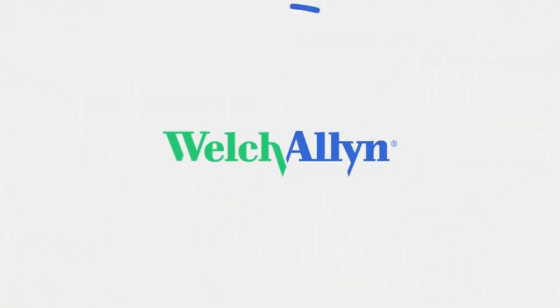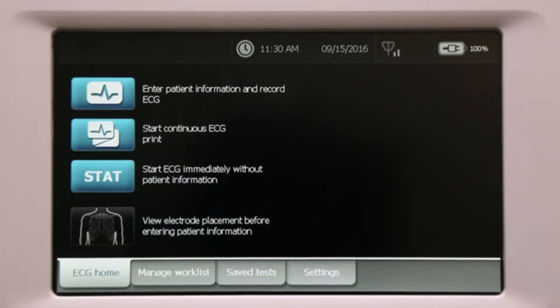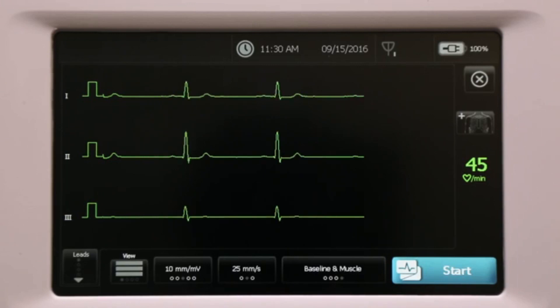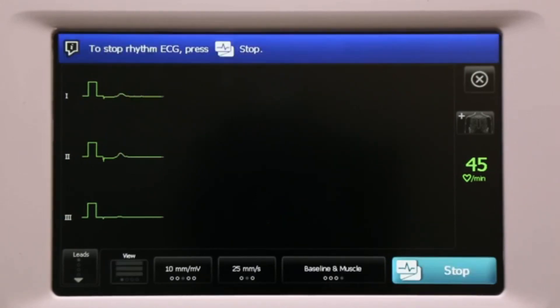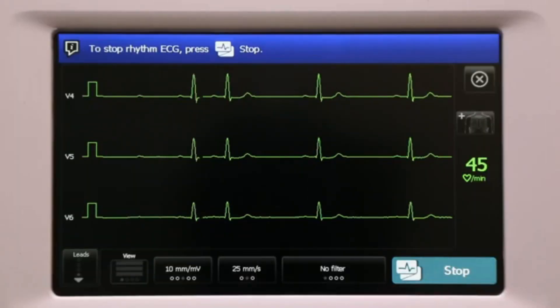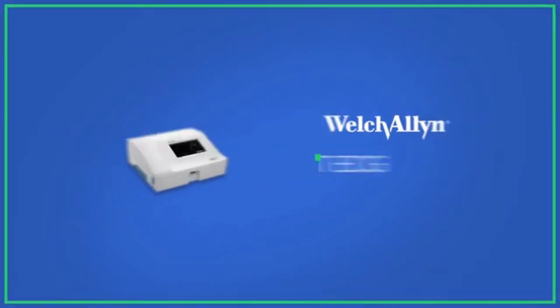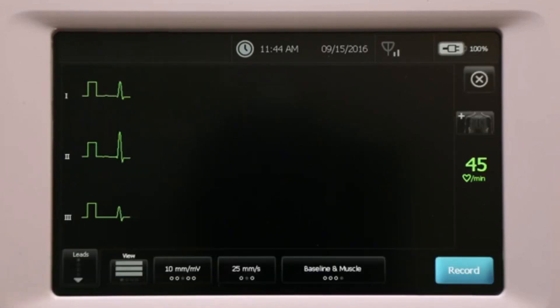In addition to Auto ECG, you can run a rhythm test by pressing the Rhythm or Continuous icon on the main screen. This feature allows the clinician to continuously print a patient's ECG. Select Rhythm and press Start, then touch Stop once complete. The CP150 also supports Stat ECGs, a feature which allows you to conduct ECG tests right away without entering patient information first — touch Stat to take the test immediately.